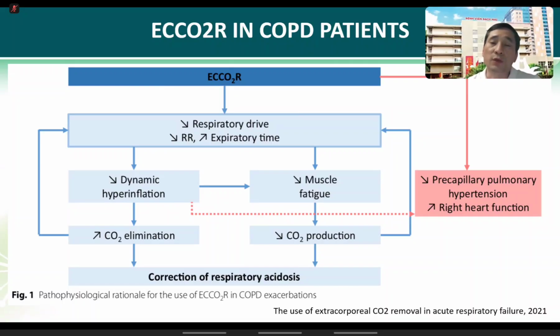So of course, when you put the patient on mechanical ventilation and positive pressure ventilation, the CO2 can go either up or down. If you do very well, you are a good doctor, it can go down because you're taking care of the patient very well. But in many cases, when doctors put on invasive ventilation, the patient's CO2 goes up, and many doctors don't know how to handle that. So in many cases, CO2 removal can be a good option for this kind of patient.